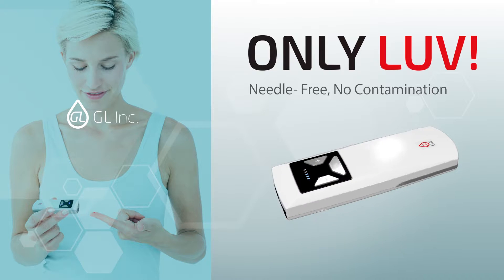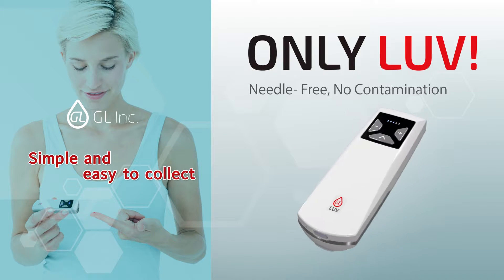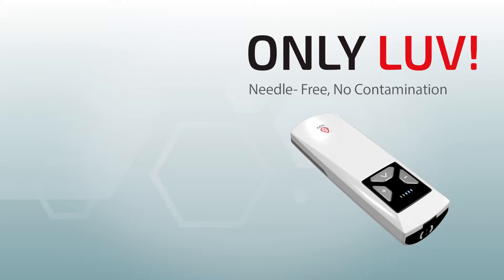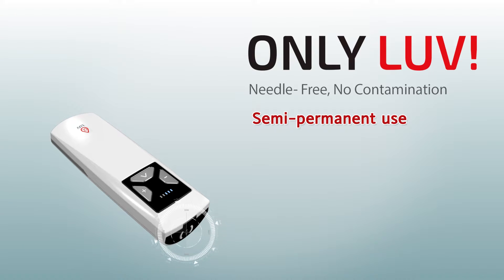We officially guarantee two years, but LUV could be used longer than the guarantee using the lithium polymer rechargeable battery. A choice of five selectable levels depends on the thickness of finger skin. Blood amount is controllable — no excessive bleeding and less pain. No callus and no second contamination.